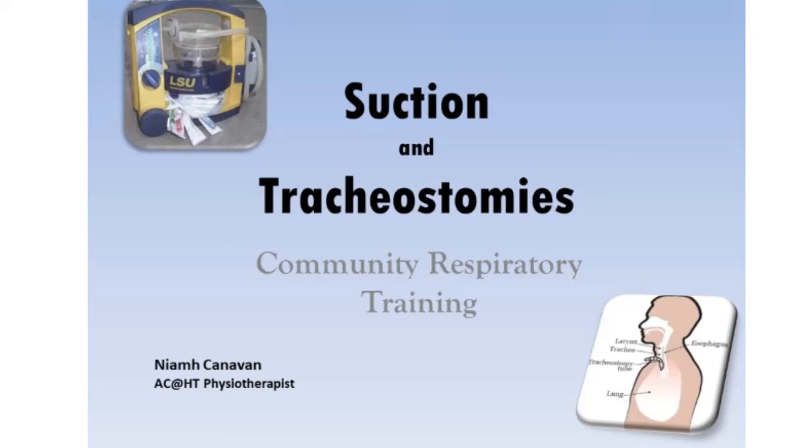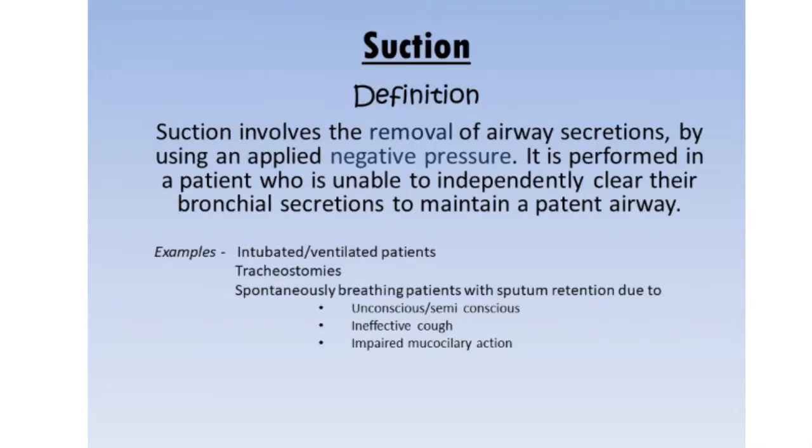Okay, so my presentation today is covering suction and tracheostomies, and this will be immediately followed by practical demonstrations. Suction is defined as the removal of airway secretions by using applied negative pressure. It is performed in a patient who is unable to independently clear the bronchial secretions to maintain a patent airway.